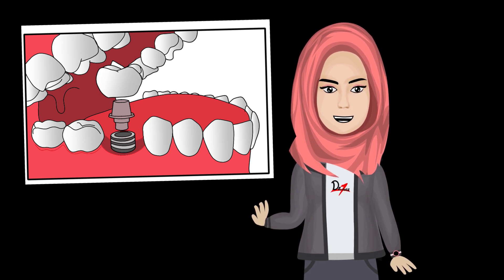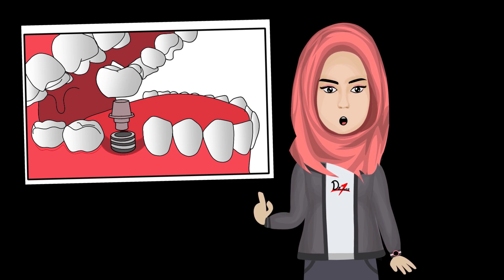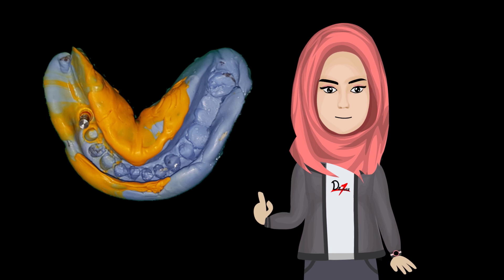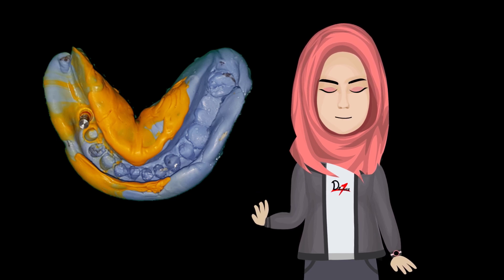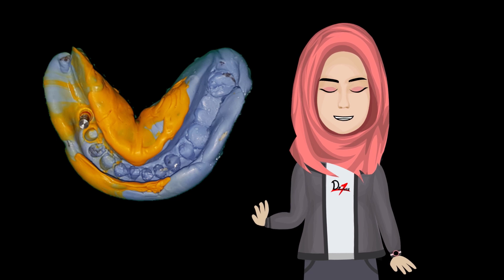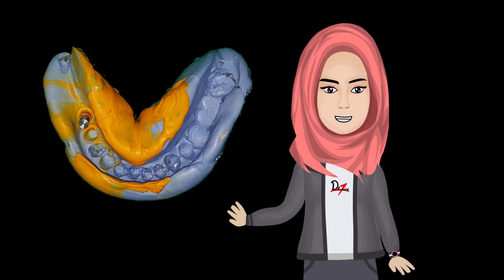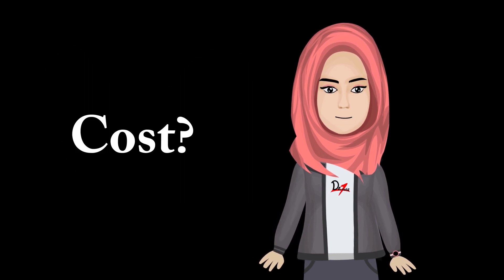The gingival former is placed for a duration of one week. After one week it is removed, and an impression is made. That impression goes to the lab and the crown is made, which is then fixed on the implant. This is how a dental implant is placed.